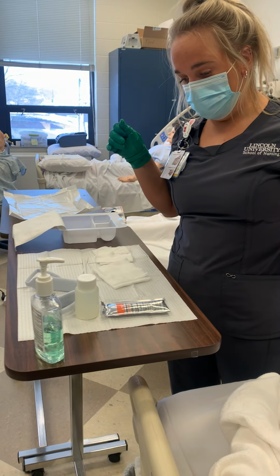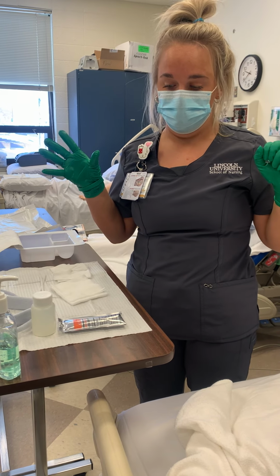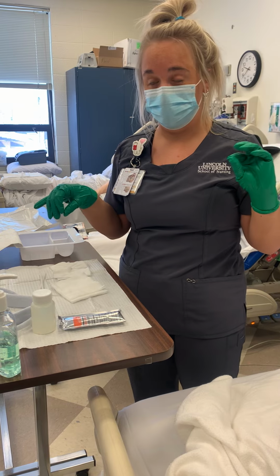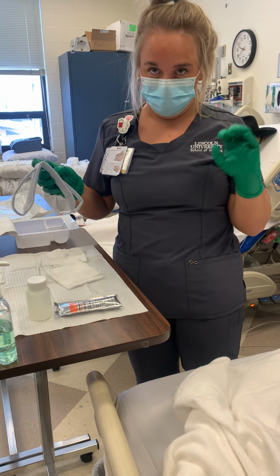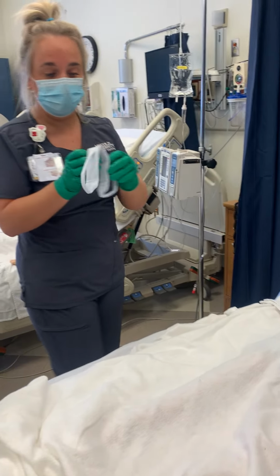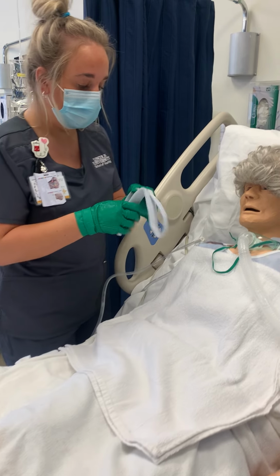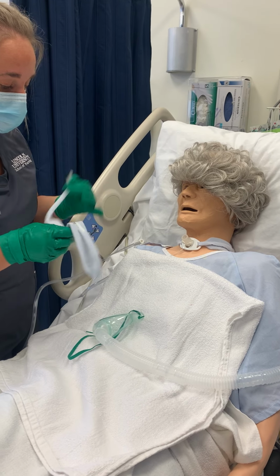Okay, so after I had cleaned everything, I'm going to go ahead and change the trach ties before I replace her new V-sponge. So now that the sterile part's over, I've cleaned her and everything like that, we can break sterility with both hands to change the ties. All right, Mrs. Smith, I'm going to remove this and we're going to change those ties, okay?